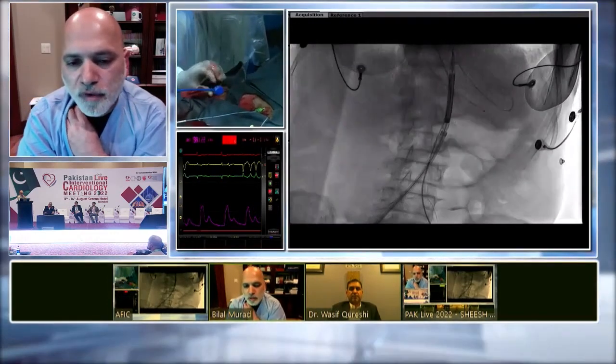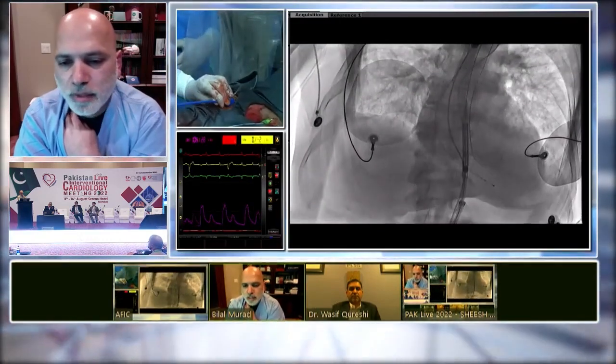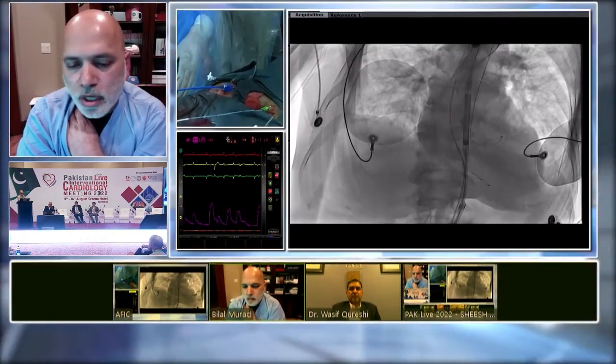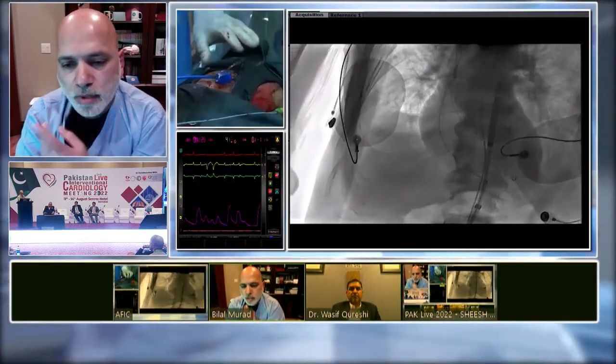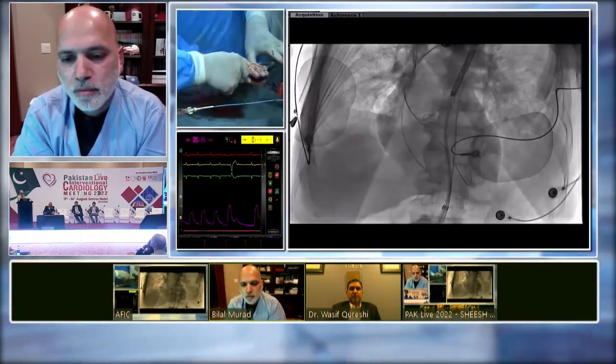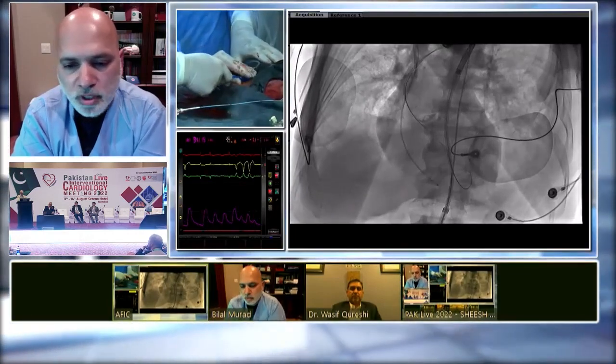And we have a venous line and we get anesthesia for drug administration. So I have a single arterial access, which is just for the TAVI sheath itself. And I'm almost exclusively using the Sapien type here, so generally speaking, it's between 14 and 16.